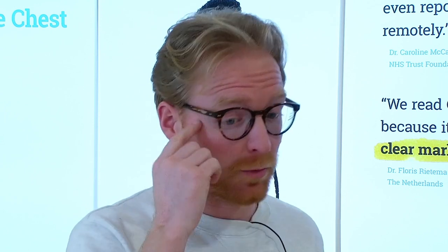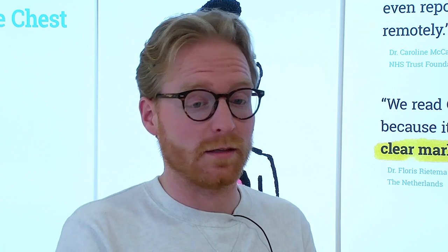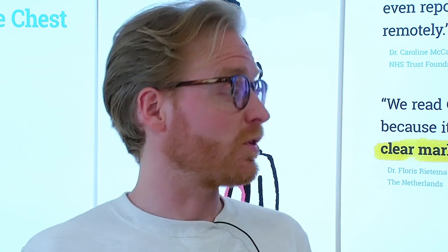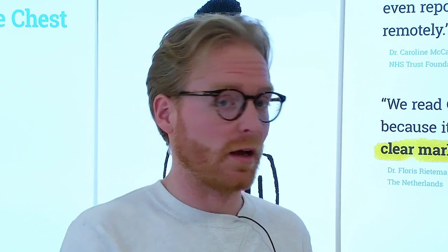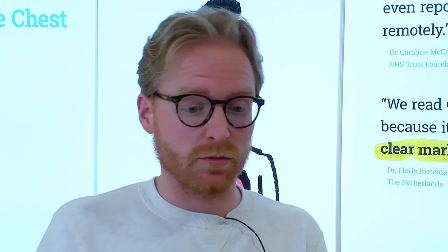So, for example, with our product, if you want to automate the reading of nodules, you look at automated detection. But if you want to actually do something with those nodules, you need to have classification, you need to have measurements, etc. Yep. So you go deeper into that part.